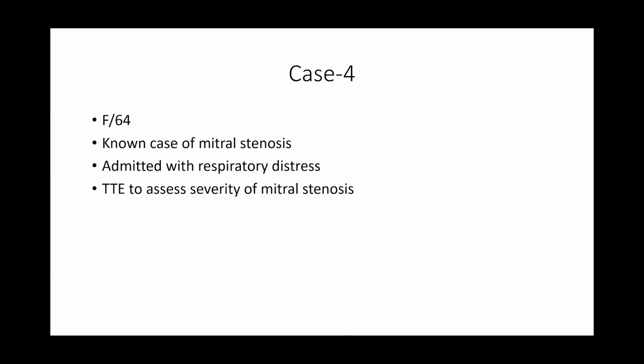So that's your history. Do you want me to take that, Vishal? Yeah. So female, 64 years of age, known case of mitral stenosis, was admitted with respiratory distress, and a transthoracic echo is done to assess severity of mitral stenosis.